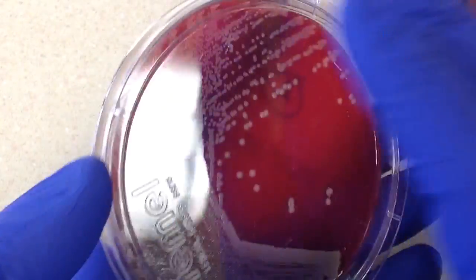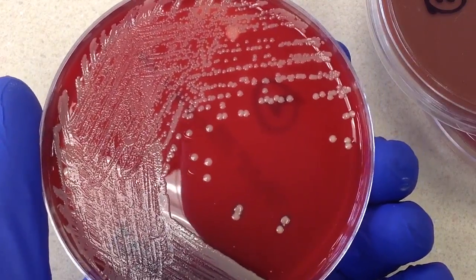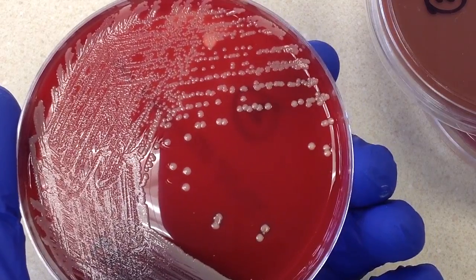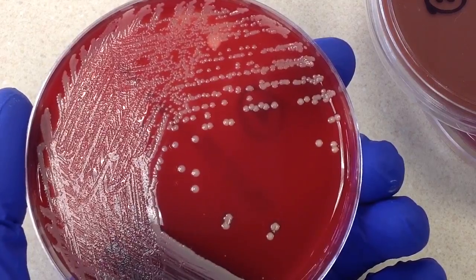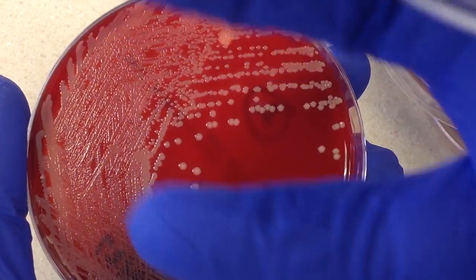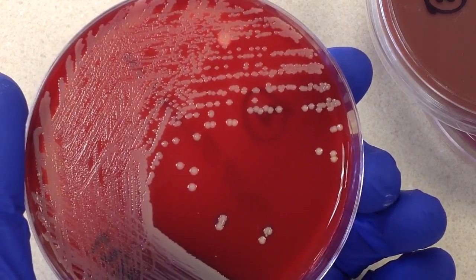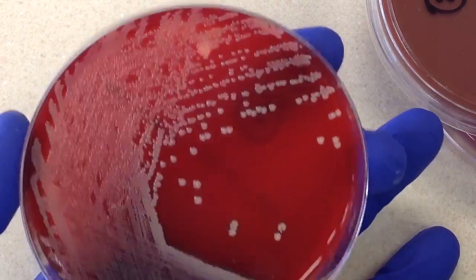Let's go ahead and first take a look at the sheep blood plate. Being that it's a superficial wound, it's possible that we could pick up some normal flora because the specimen was collected from the skin. On this particular culture, I'm not seeing any kind of normal flora. Sometimes normal flora can get overrun if you have one dominant organism, but I don't see anything on here.